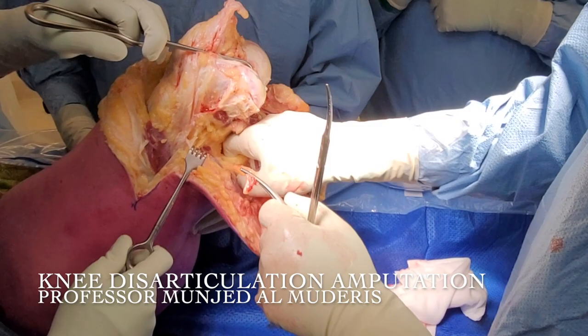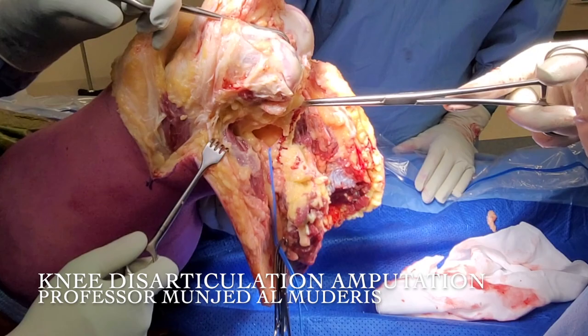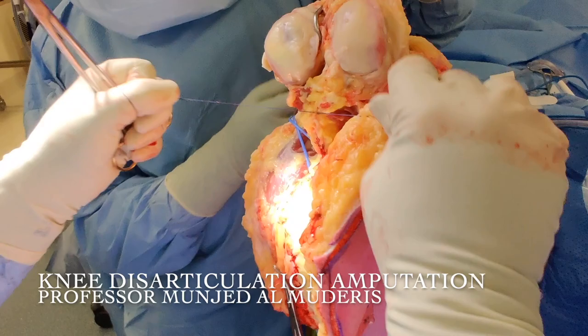We follow the common peroneal nerve down in the thigh, and the tibial nerve is just close to it. I perform targeted muscle reinnervation at this level. I resect the lateral gastrocs as well as the medial end of the gastrocs. The vessel appears at the back of the knee — you can see this is the popliteal artery. You can find the peroneal nerve at this level as well. We need to ligate the vessels. I'll put multiple ligatures into the vessel, considering that it's a very large artery and the chance of catastrophic bleeding is high if the ligature slips.